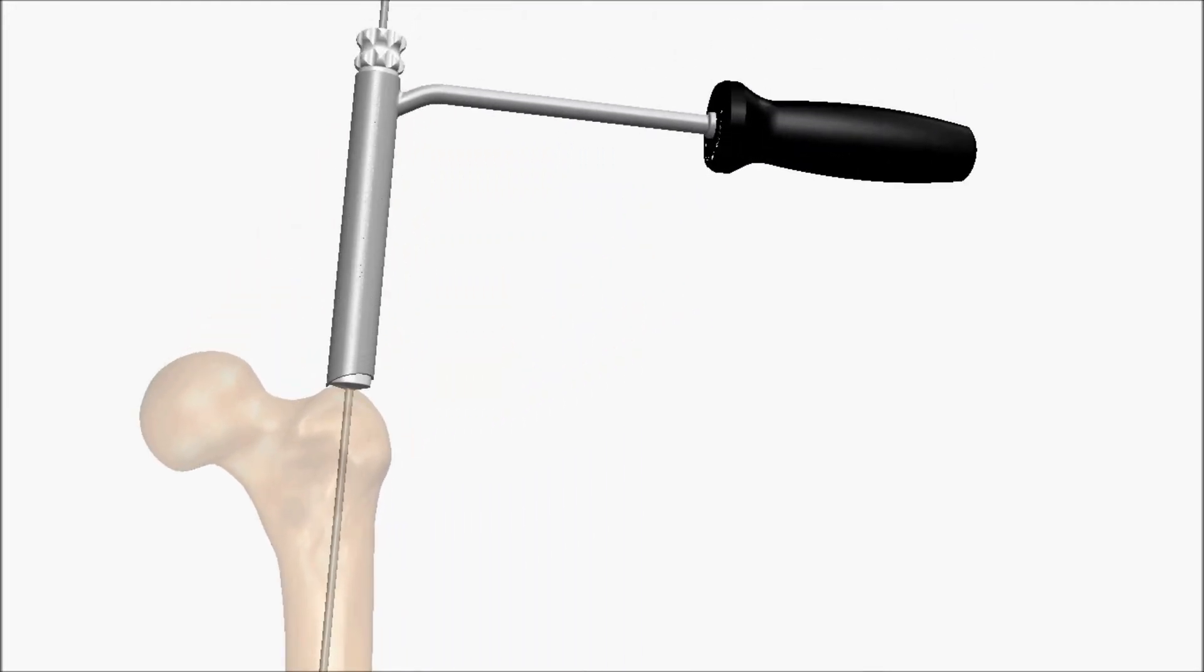use the proximal reamer to open the femur. Reaming depth is at the discretion of the surgeon, but should be to at least the first groove on the reamer blades as seen radiographically. Take care not to remove bone from the medial cortex.